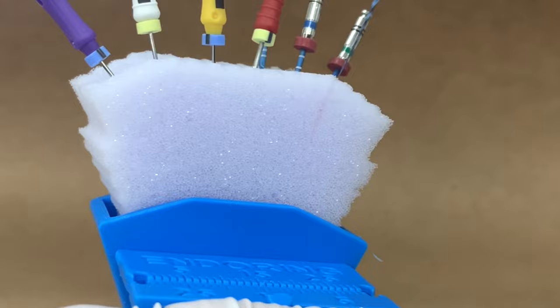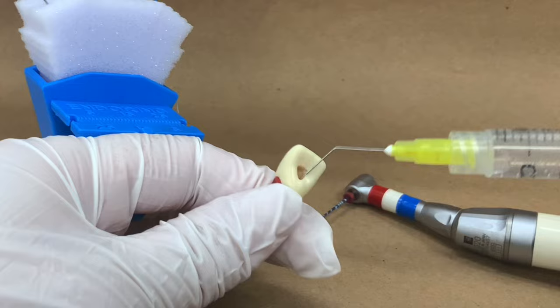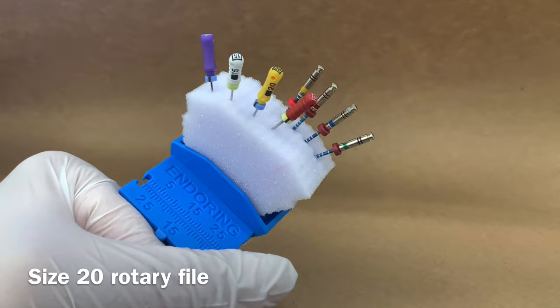Wipe the flutes of the file clean using the endo sponge or alcohol wipes. Irrigate after each file. It's also helpful to keep a few drops of irrigant within the canal at all times during cleaning and shaping.